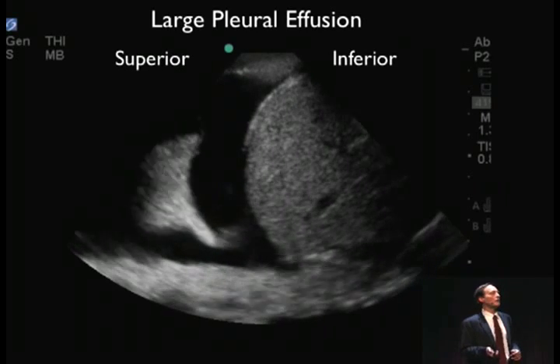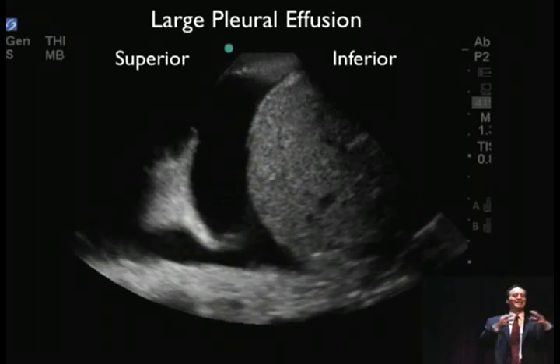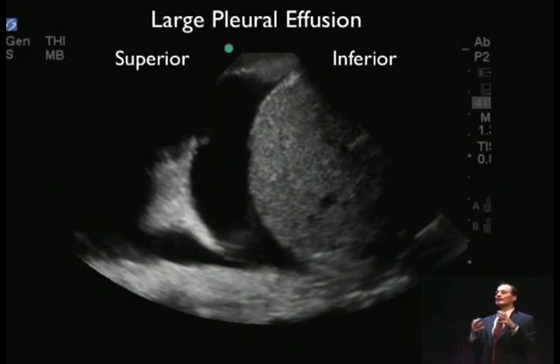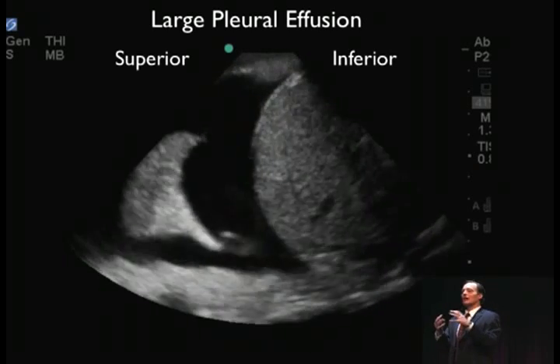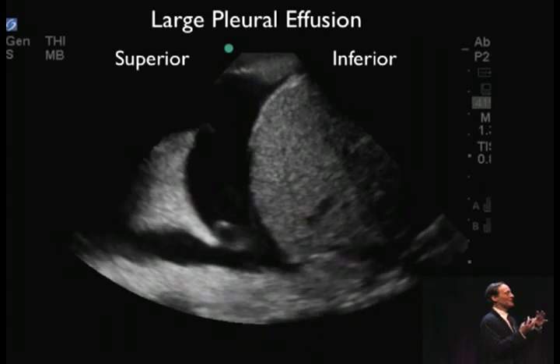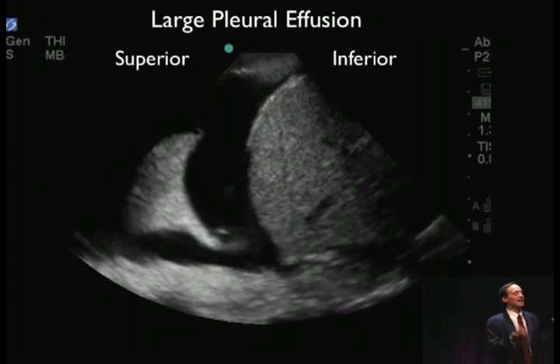How about this one? Gunshot wound to chest. Blood pressure is 40 over palp. Look at that poor little lung just compressed down by all that fluid. What pulmonologists call this is hepatization, because as the lung gets so compressed down by all that fluid, it takes on the look of a liver inside the chest. That poor little lung is so compressed down, it can't get any oxygen into it.